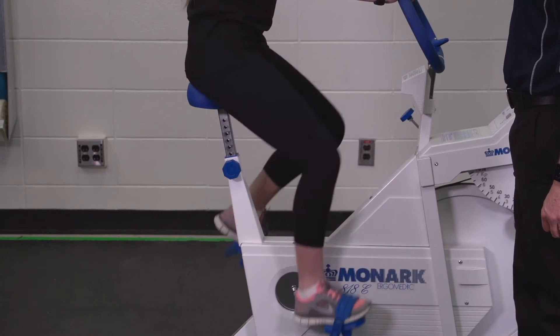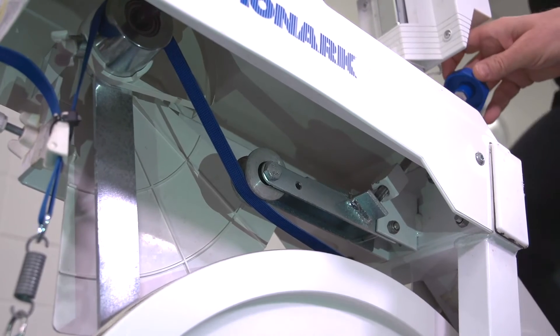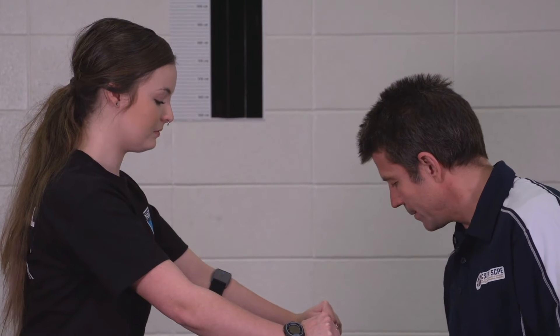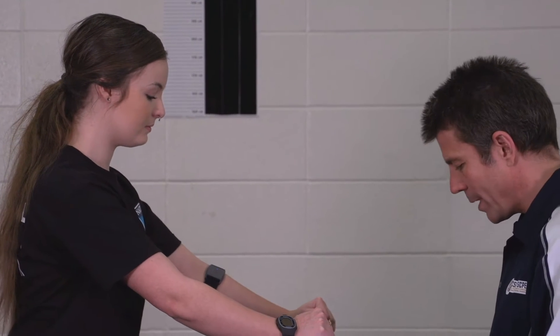I'm going to put on some resistance. Now remember, just 50 RPM — just slow down a bit there. Perfect, 50 RPM on the nose. I'll turn the metronome on as well.